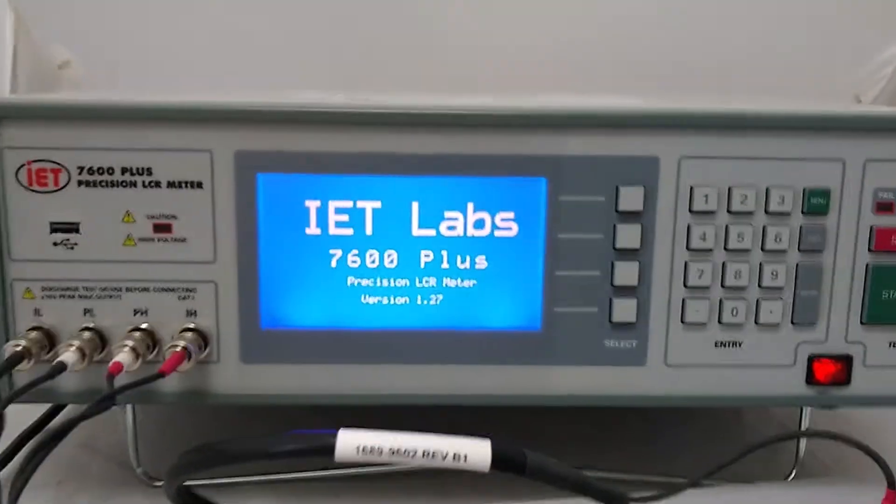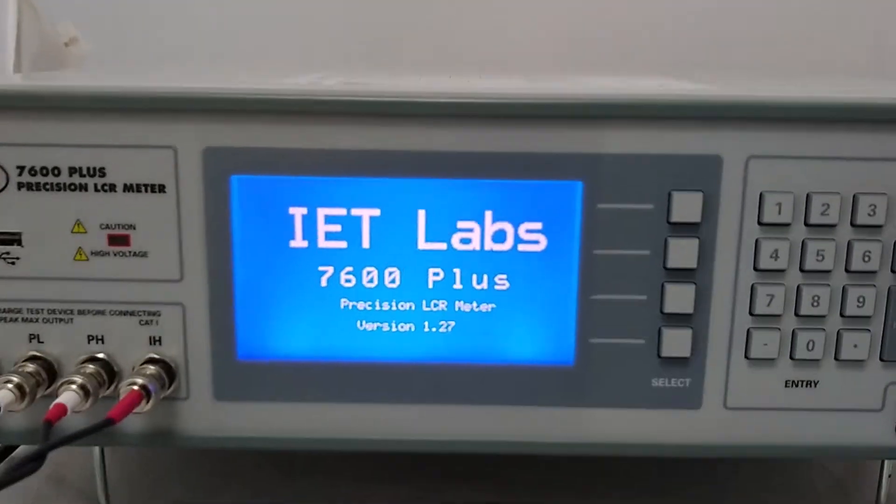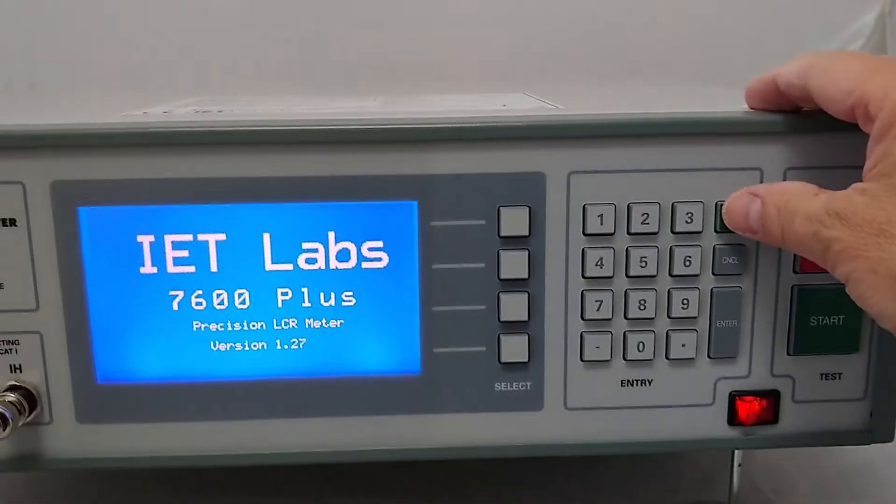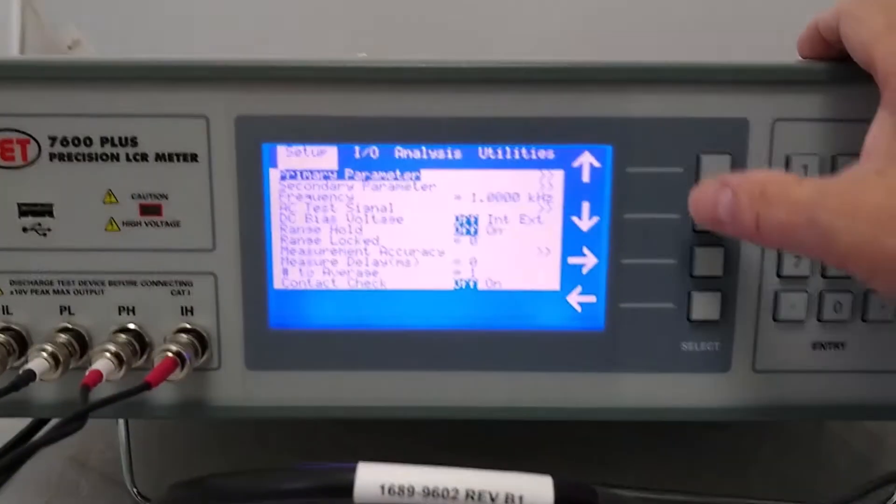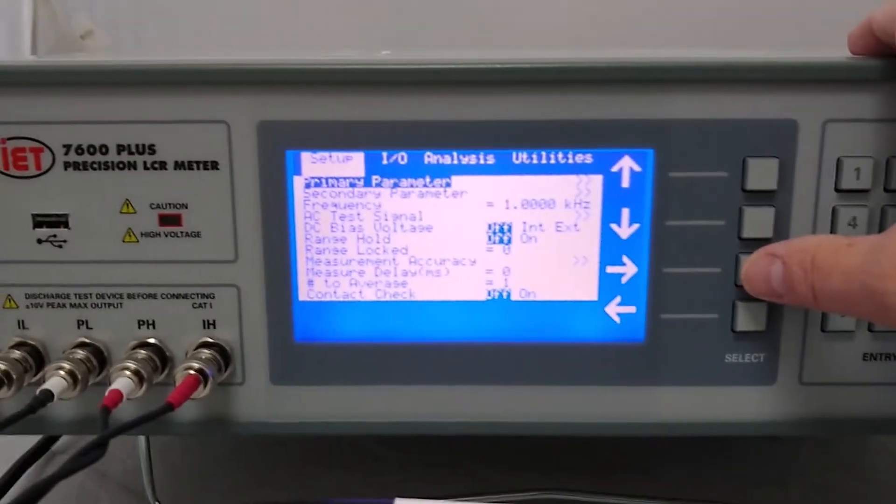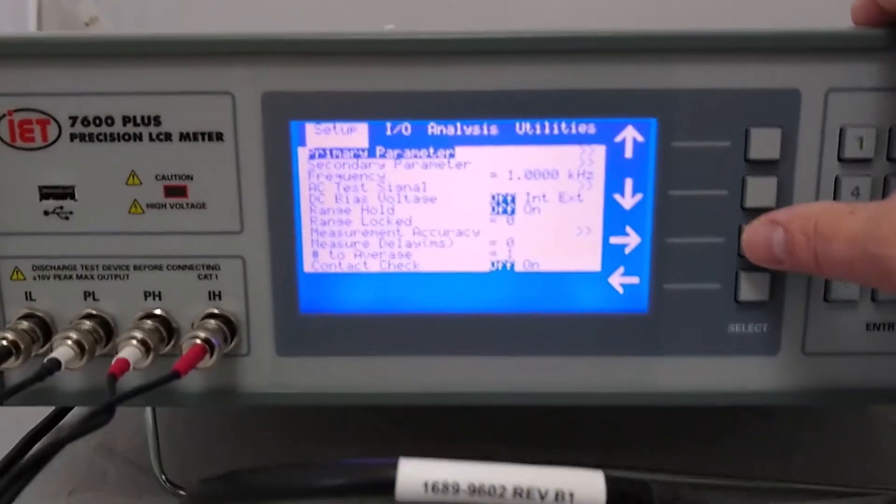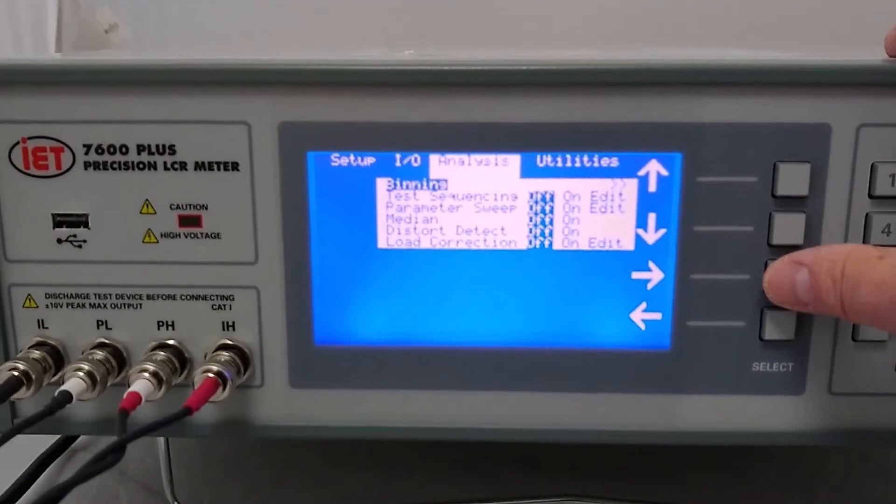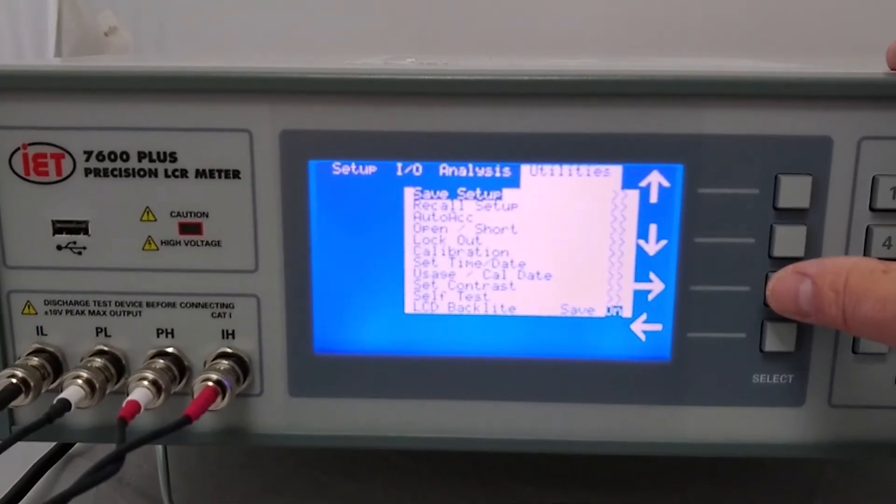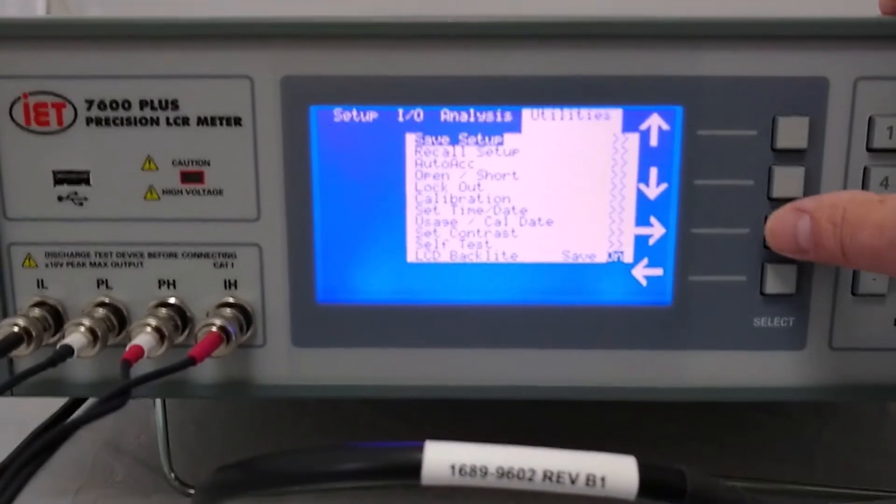The next step is to actually configure the 7600 Plus by first pressing the menu button. This allows you access to the four menus within the 7600 Plus which is setup, IO menu, analysis menu, utilities menu which we'll do open and short and we'll do that in just a moment.